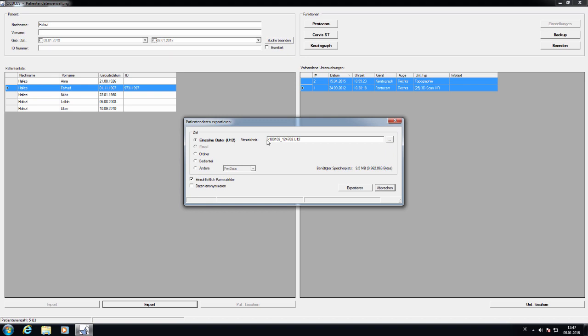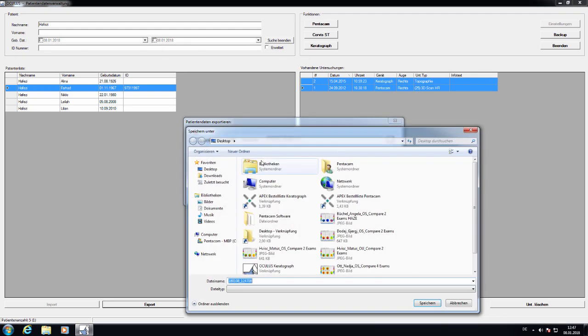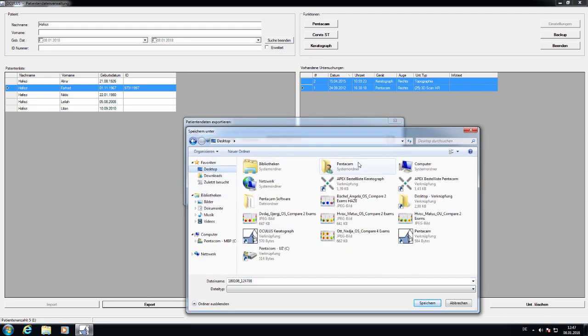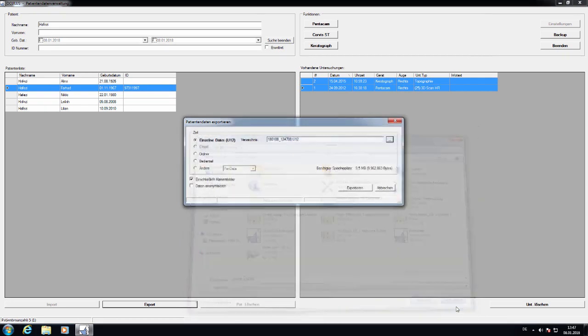This is the internal ID of the exam. You can then change the location to which the U12 file should be saved. It can be a USB stick. And then you simply press Export.